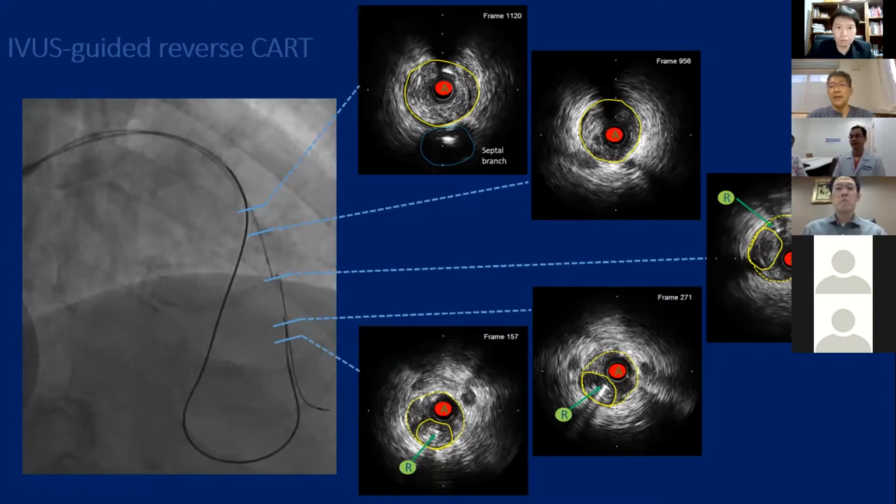So maybe I recommend, when I make a connection to penetrate this space, the Gaia second, Gaia third is better usually.